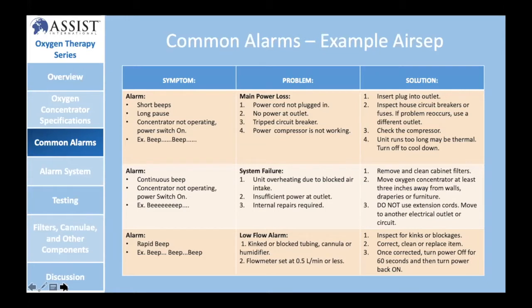When we were trying to put all of this content together for you, one of our team members brought up an experience where they found that the hospital had cut the audible alarm out of the oxygen concentrator because it was just making an annoying sound. Please do not do that.